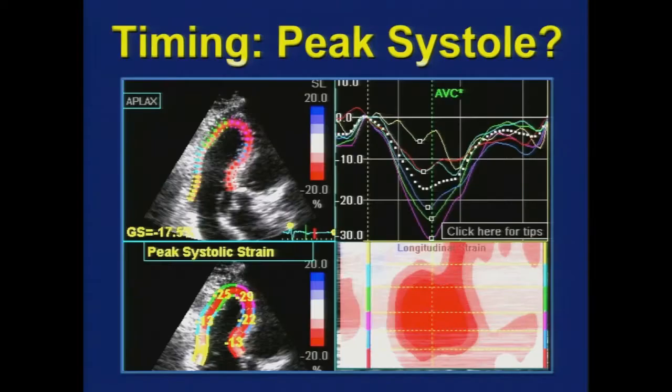This is global longitudinal peak systolic strain. So we need to define peak systole. And for this, we really look at the concept of aortic valve closure. And that's why we often have to begin by looking at this apical 3-chamber view, where we can see the motion of the aortic valve, and we time peak systole to the closure of the aortic valve visually. With Doppler, you can just look at the closure clicks of the valve. With M mode, if they show you that, it's just when the aortic valve closes. So peak systole is really defined at aortic valve closure.